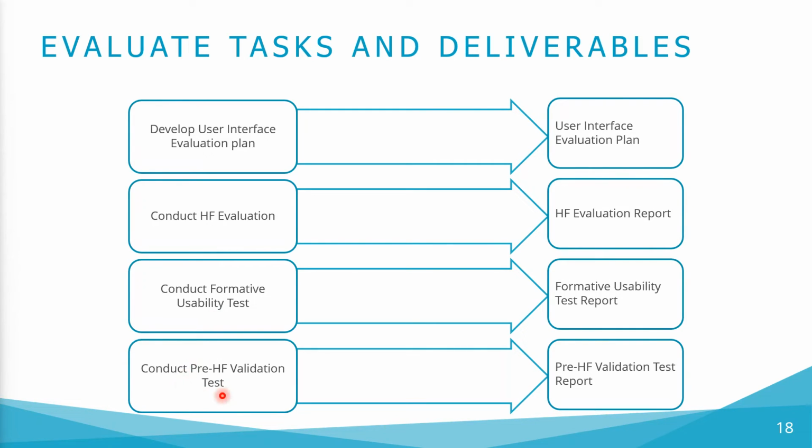Conduct pre-HF validation test. A pre-HF validation test is the final formative usability test you conduct before proceeding to the HF validation test. It is an opportunity to conduct a dry run of the HF validation method as well as identify any final use-related issues that must be addressed before finalizing the design and proceeding with the HF validation test.